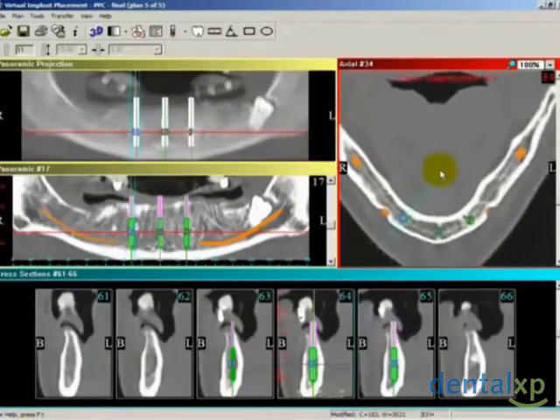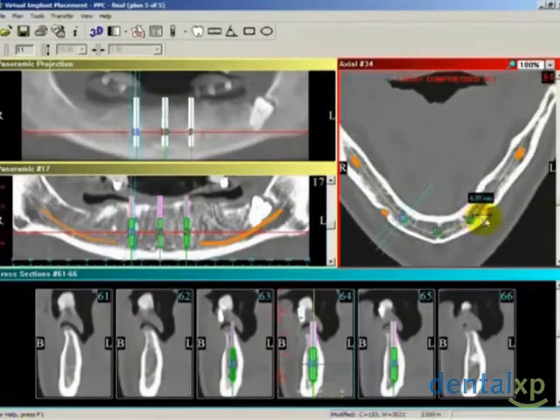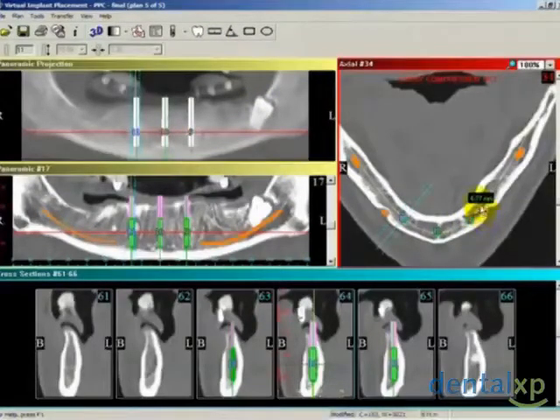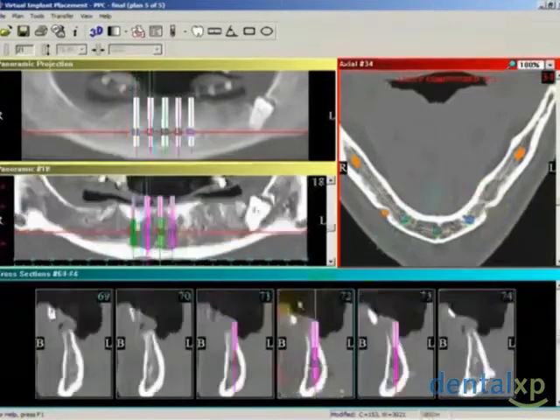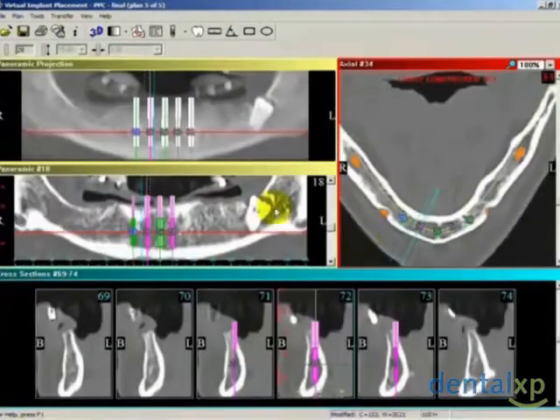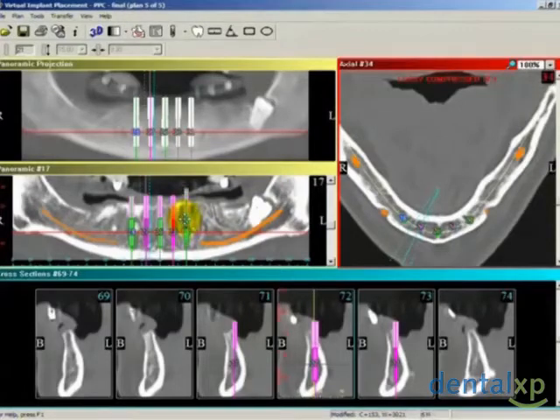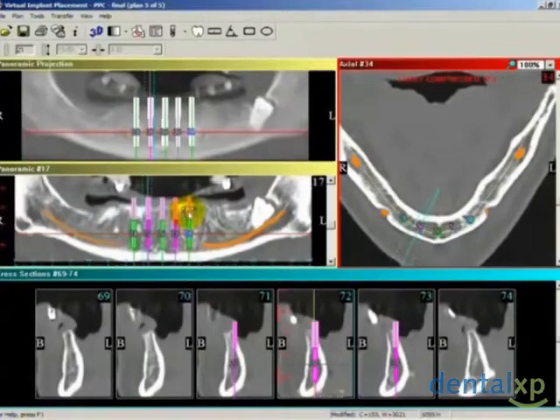Measuring tools accurately determine distances, angles, areas, and average densities. A ruler tool is used to gauge the edge of the implant from the mental foramen. In selecting the 2.2 millimeter implants, you will notice the manufacturer's default color differs from the 3.25 millimeter implant previously placed.